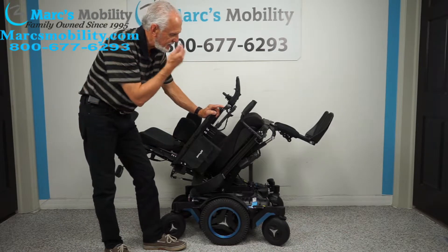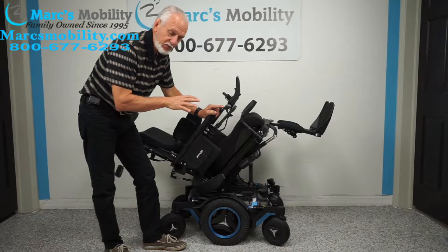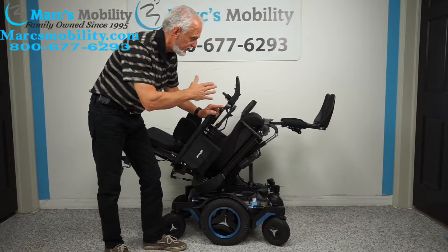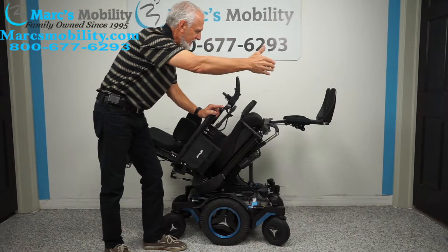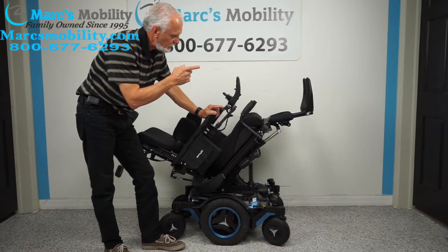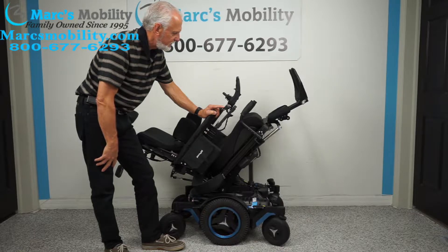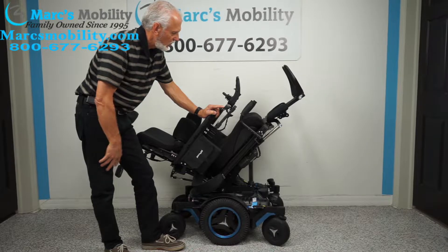The next function is the electric legs. Remember, these chairs are fully adjustable — so if you're 100 pounds or 300 pounds, we can adjust the seat, the legs, the length, all of that for you. But I want to show you how high you can get your legs up — look at this, folks.